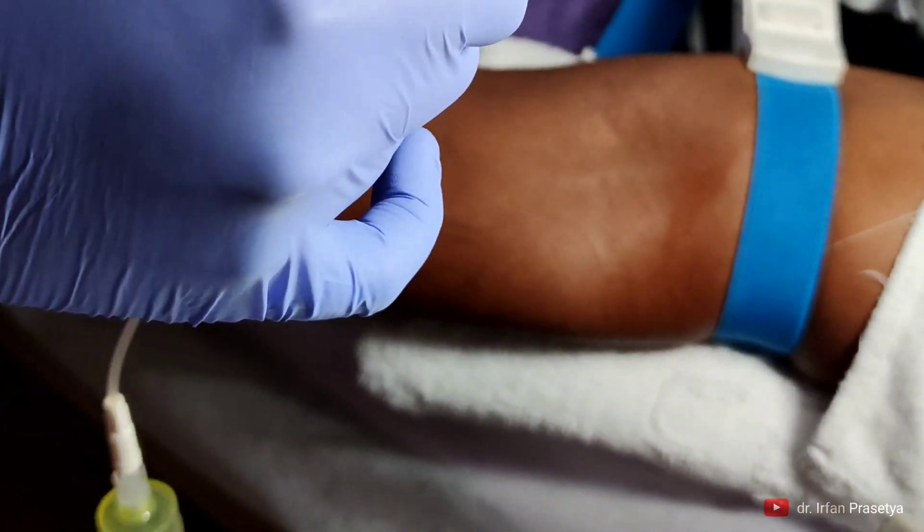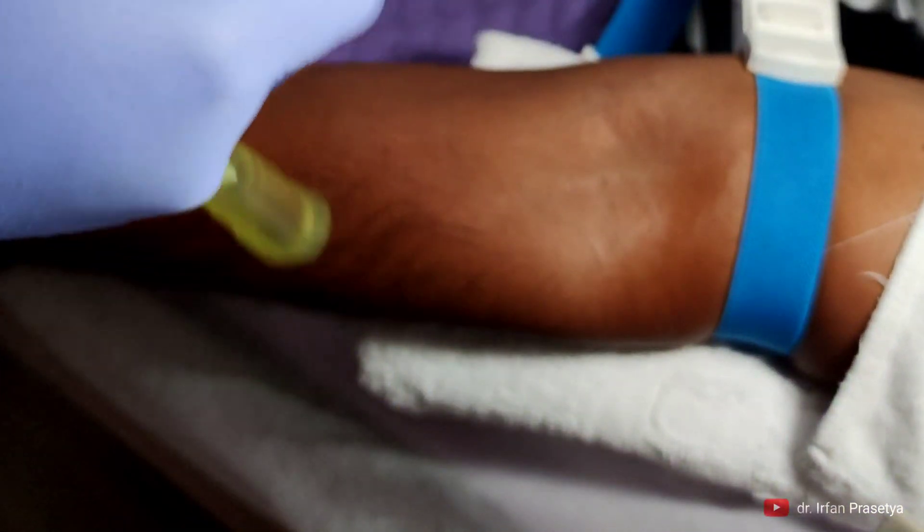Sebetulnya pengambilan darah seperti ini bisa dua model yang biasa kita jumpai, yaitu manual — pakai sepet, pakai siring namanya — dan yang kedua adalah yang menggunakan alat, pakai vakum, vacutainer, yang sudah saya praktekkan di depan.